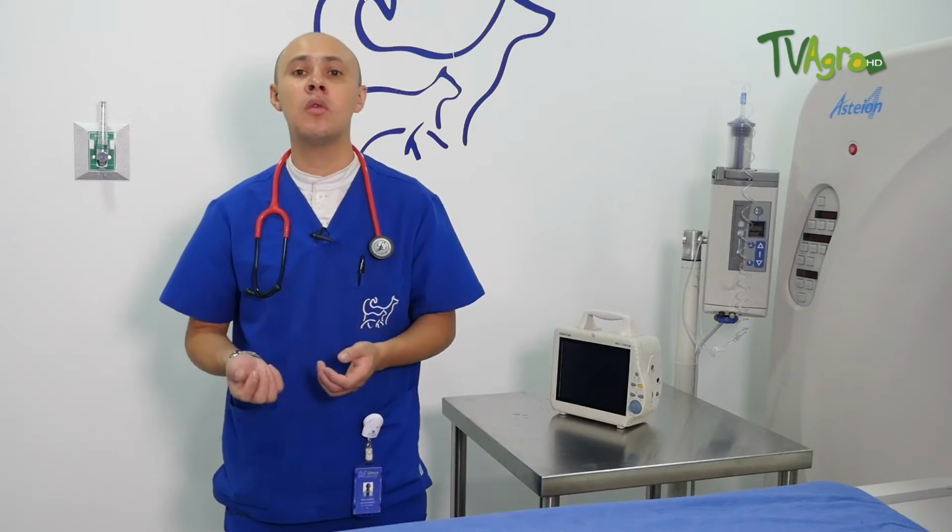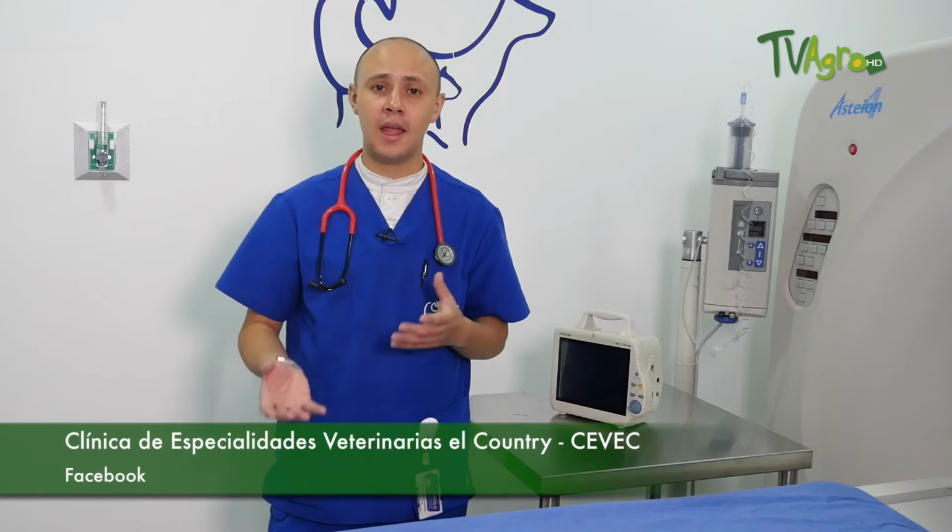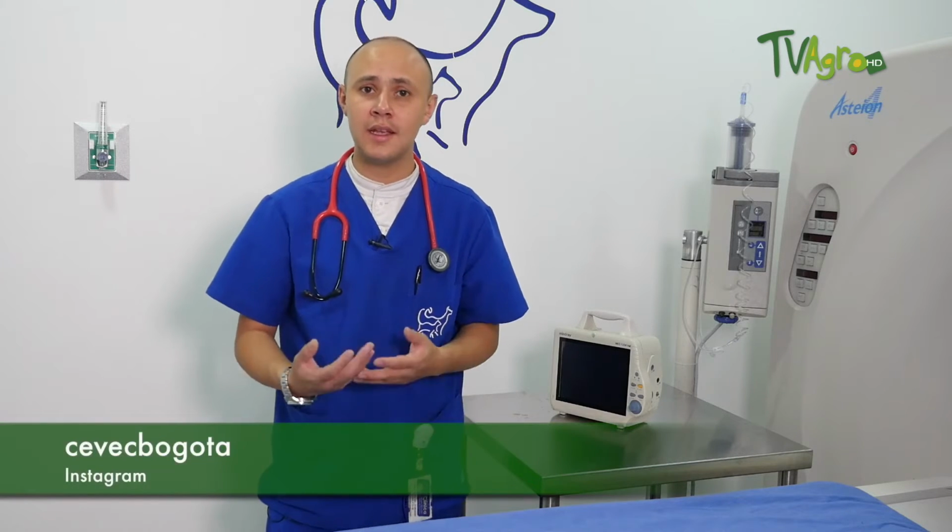The idea is that as we have everything corresponding, our medical team and facilities, the patient recovers and exits as he enters here. And also that the owner is assured that his patient will not be under any anesthetic influence after he leaves the clinic. Taking into account that this is a procedure under general anesthesia, the idea is always to have a patient as stable as possible. This gives us a slight limitation in case we would like to refer a patient, because the clear idea is that the patient should have the corresponding study and leave as it was admitted.